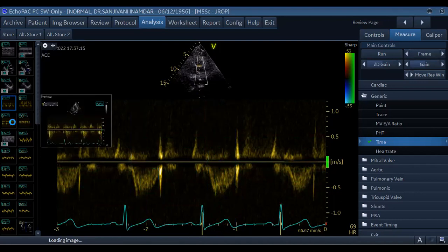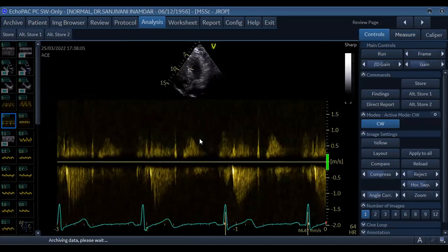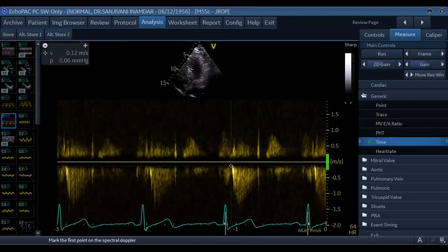Okay. Look, this is very clear. Now, if this is aortic only, to measure this timing I'll go to measure, go to timer. This is onset to peak. Now look at my cursor, it will stop at the peak. Sir, is it the slope? Slope would be different.